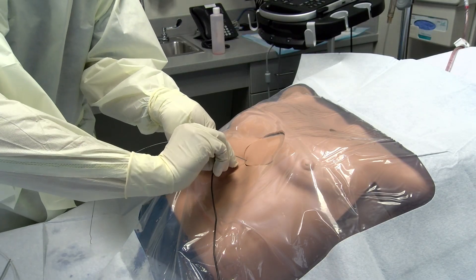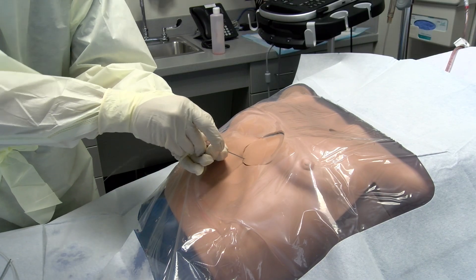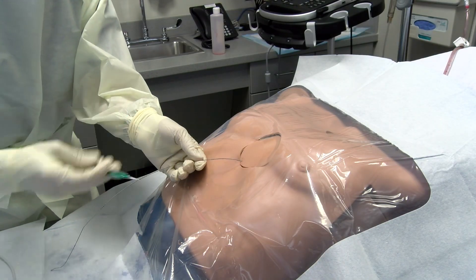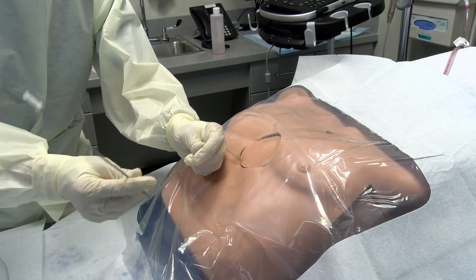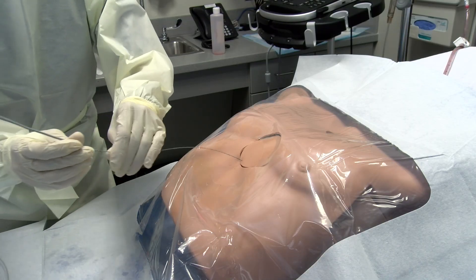Once the guide wire is advanced, the needle may be withdrawn and a skin nick made using an 11-blade scalpel. Volumes as small as 50 mL acutely can lead to hemodynamic changes, while chronic effusions can grow much larger before an effect is seen.